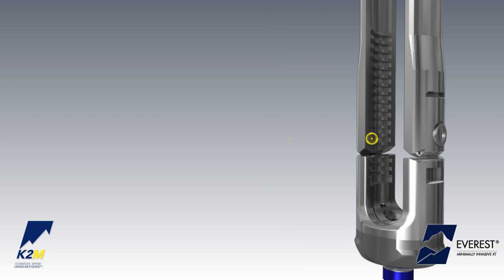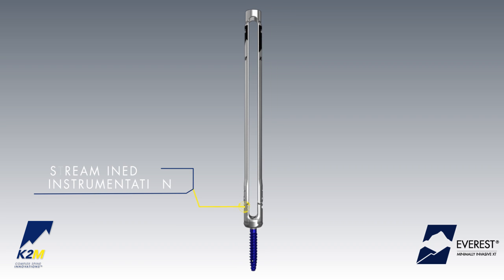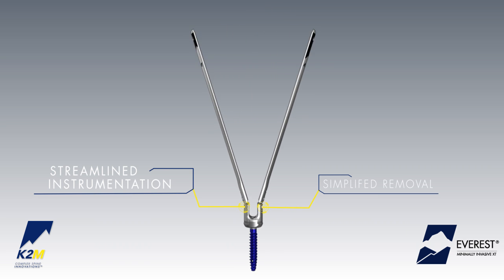Built-in threads within the extension tabs allow for 25 mm of internal rod reduction. Streamlined instrumentation allows for simplified extension tab removal after final locking of the construct.